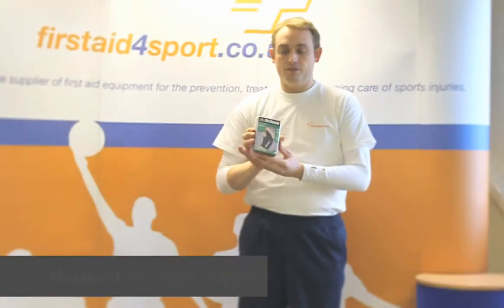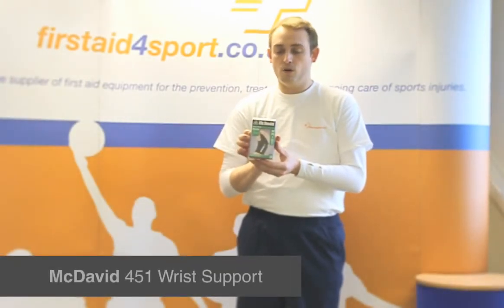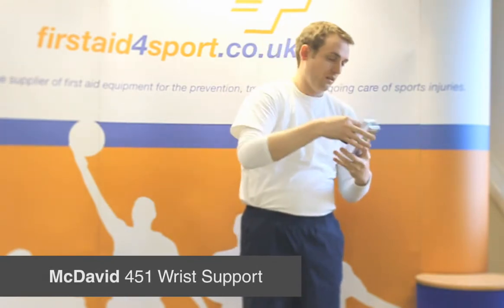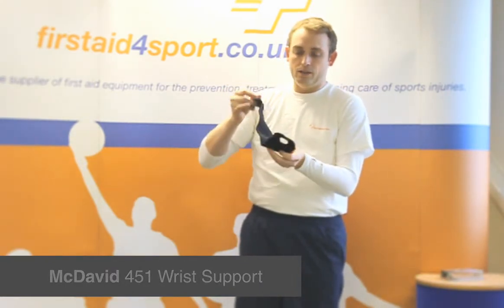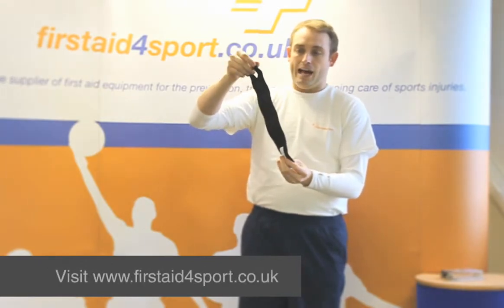I'm Michael Davison, Managing Director of First Aid for Sport, and this is the McDavid 451 Wrap Around Wrist Support. This is a very basic wrist support from McDavid, often used by physios to have in their bag.